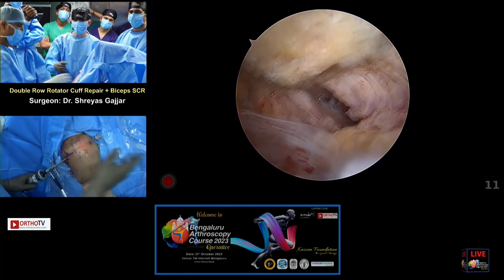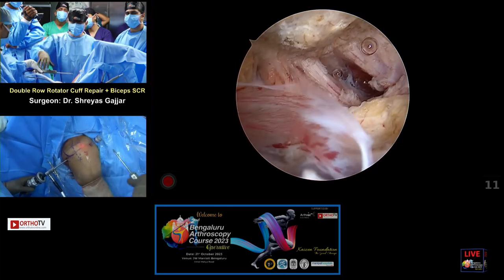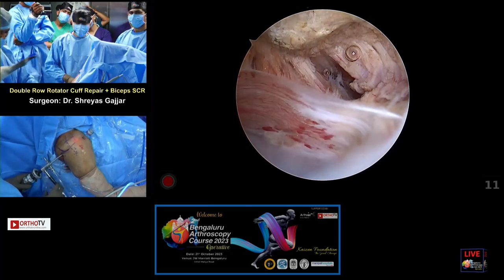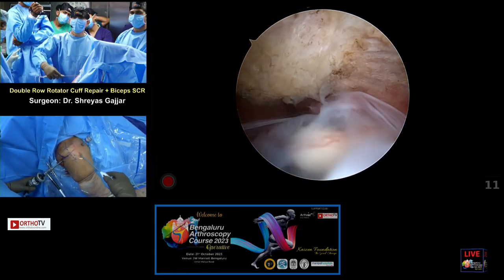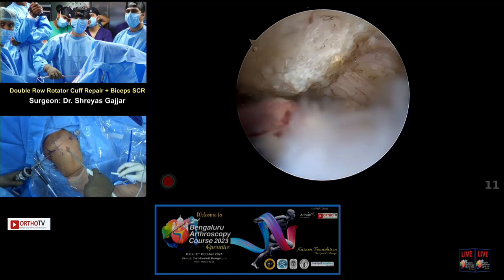Now we're just going to do the burr, please. So, you know, whether to do acromioplasty or not to do is questionable. My reason is to just, before that, RF, please. My reason is to just create a bleeding area for the tendon healing. So my RF is coming through the anterior lateral portal.